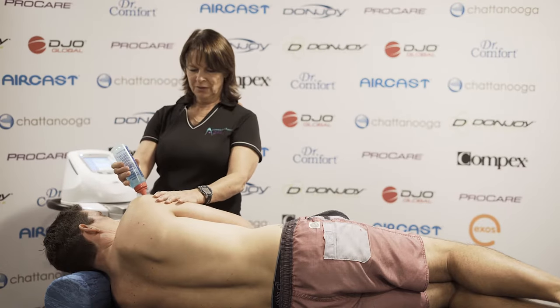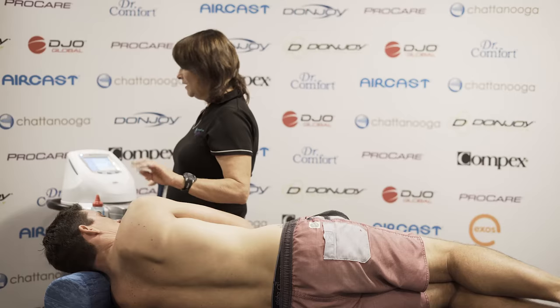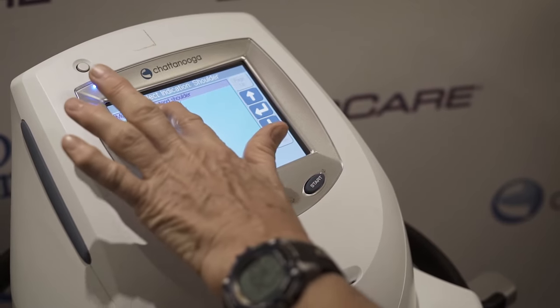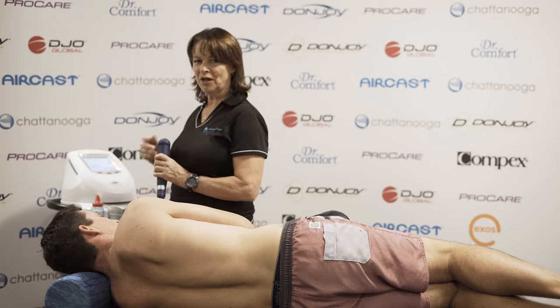We usually apply a gel to the area for conduction. After we've applied the gel, we set up on the screen the treatment protocol according to the injury and the dose we wish to give to the client.